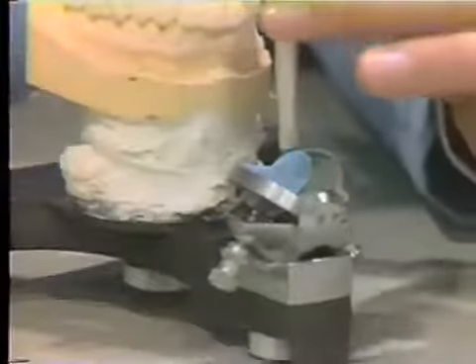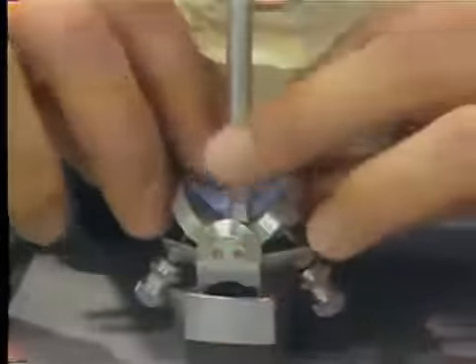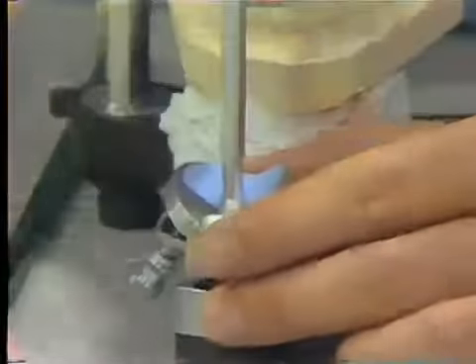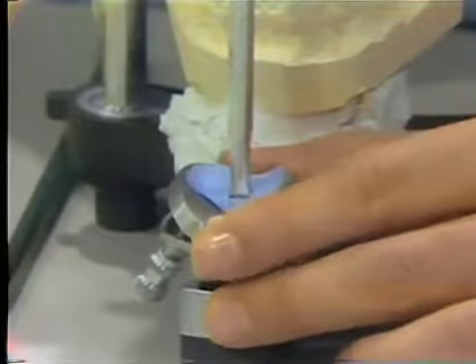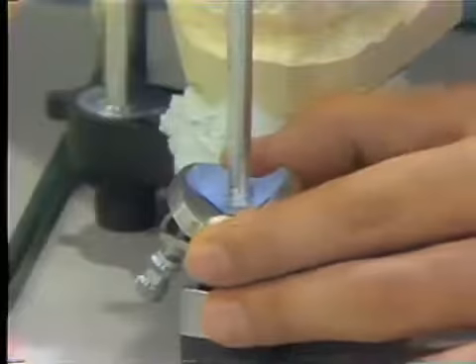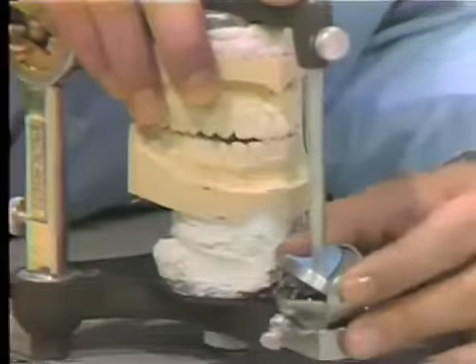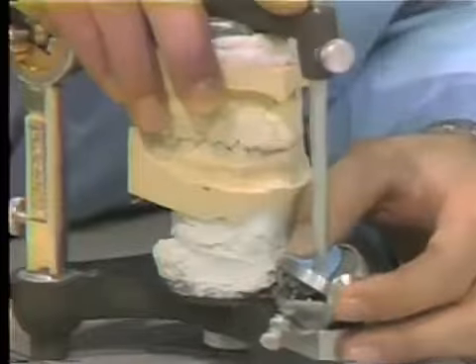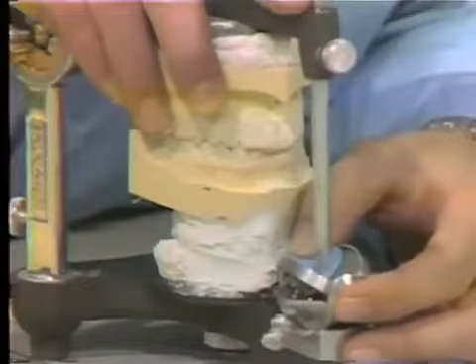Now we should be sure that the casts are in centric occlusion originally, so we're going to raise the incisal pin and then drop it to make sure the acrylic does not interfere with the centric occlusion. Now while it's solidifying, or while it's becoming hard and it's still molten, we're going to simulate the protrusive excursion with the stone cast, putting them in their end-to-end relationship. And we're actually molding the plastic with the incisal pin.